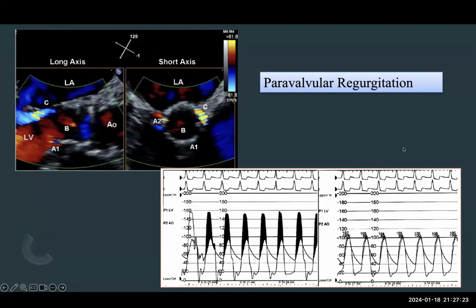Guys, one more question. Doctor, there is a question in the chat box from Mishari. What's the role of the CNS protection device? Sentinel. I usually do it as long as there is approval. Studies showed it does not reduce overall stroke, but it definitely reduces the large stroke. And this is what we are looking for, Ibrahim and Mishari.